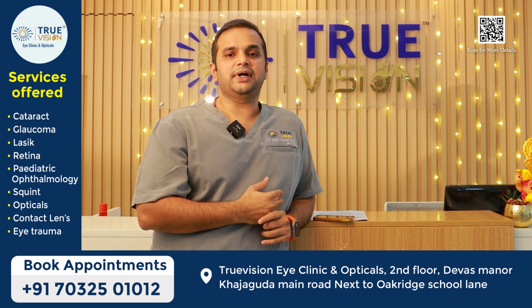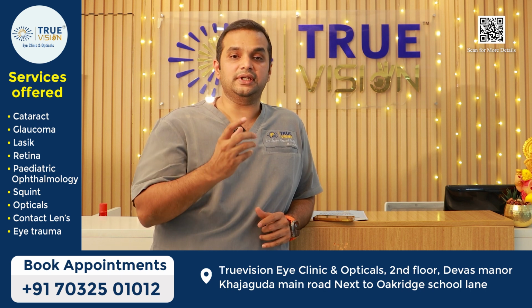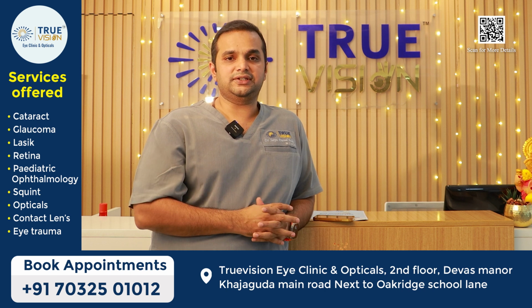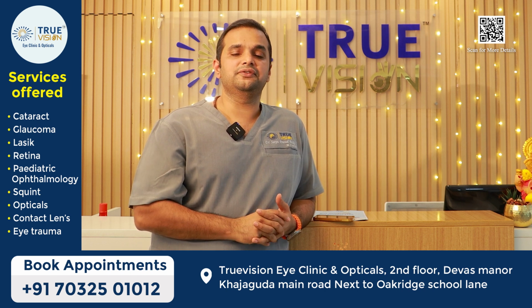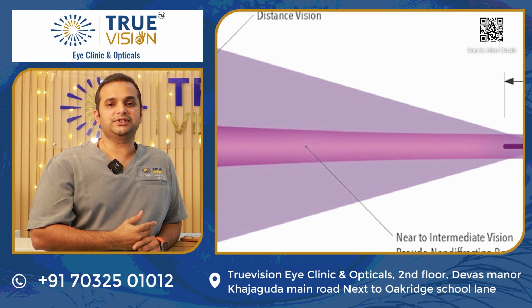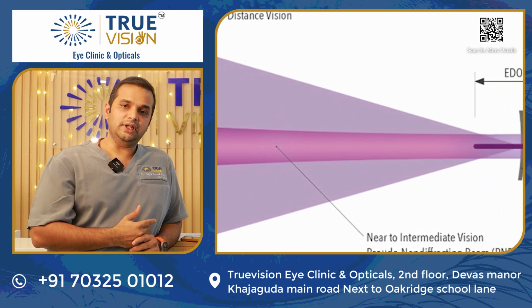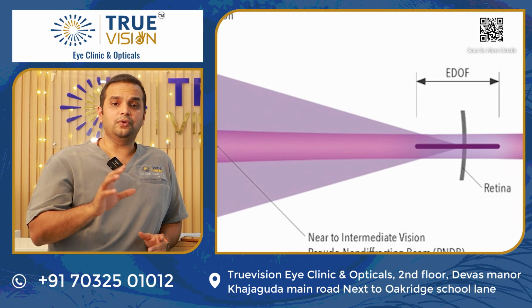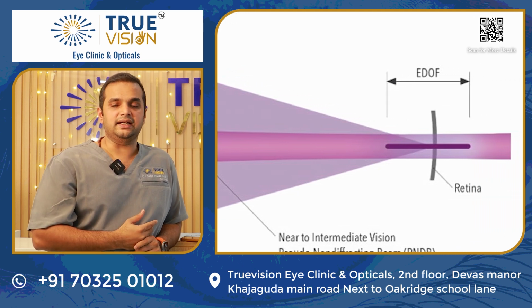So for the remaining part of it, you might need to wear reading glasses. Other than that, the EDOF lens also gives a very good result. This lens can be used by patients who are again in the older age group, and also in the active age group, who are okay with using just reading glasses.